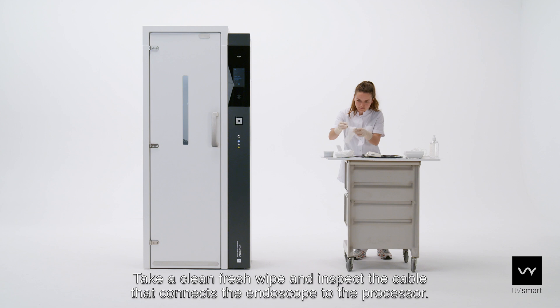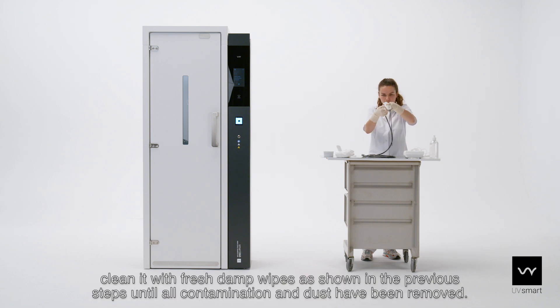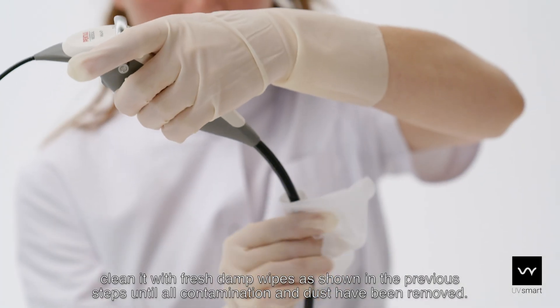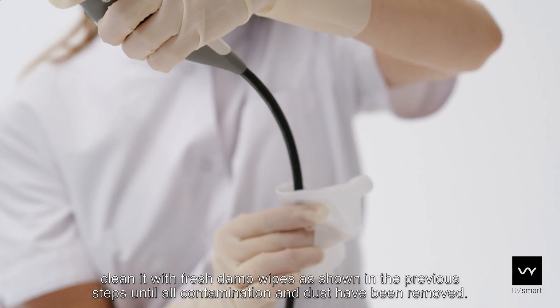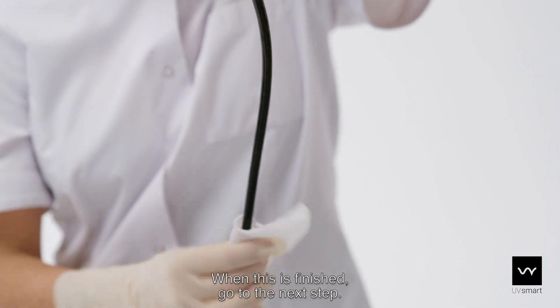Take a clean fresh wipe and inspect the cable that connects the endoscope to the processor. If the cable is visibly contaminated or if dust is visible, clean it with fresh damp wipes as shown in the previous steps until all contamination and dust have been removed. When this is finished, go to the next step.